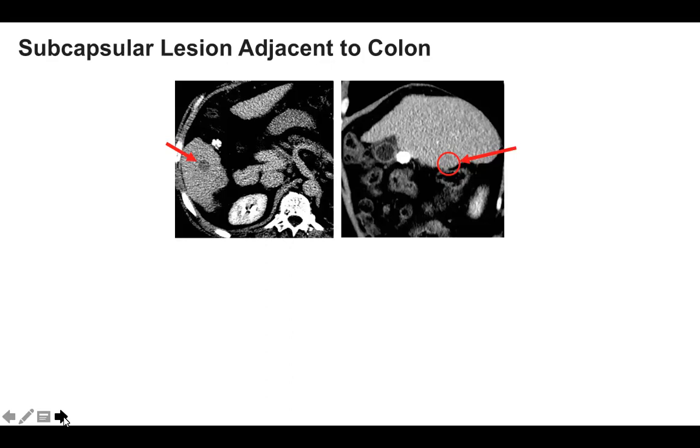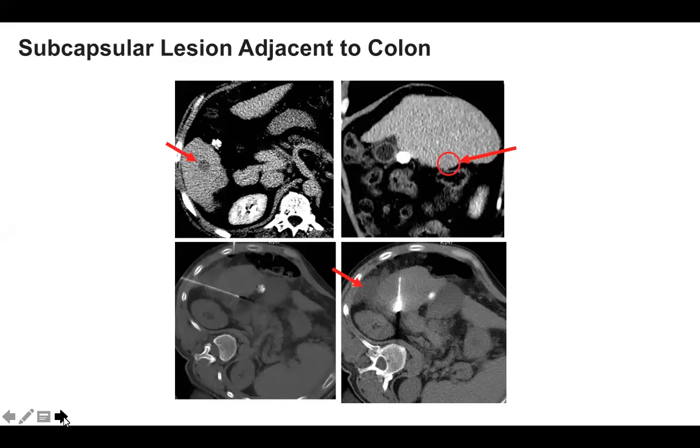And the areas of the body that I'm very concerned about are the retroperitoneal structures, the colon, the duodenum. These are relatively less mobile structures, and so as you start the ablation, if there's a component that's adjacent to your ablation zone, it could be very easy to get injured. So I have a low threshold to employ hydrodissection in this setting.